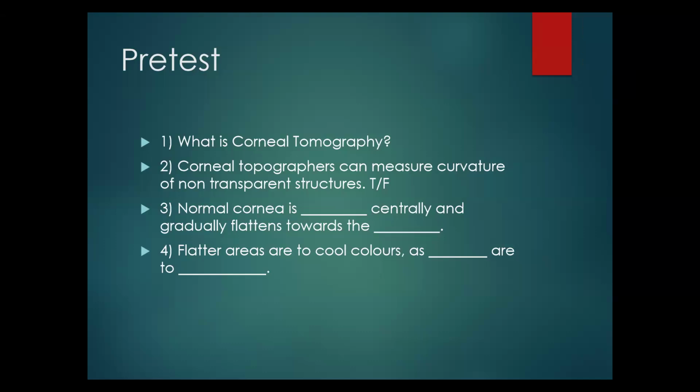So the word tomography has to do with sectioning and layers, right? If you apply it to corneal tomography, you are looking at the sectioning and having an understanding of different layers of the cornea, as opposed to surface analysis or topography of the cornea. I needed to bring that to attention, and not just looking at the examination from the anterior to the posterior surface, or looking at the two different surfaces or areas of the cornea, that is the anterior and the posterior. Doctor, I agree with you on that.